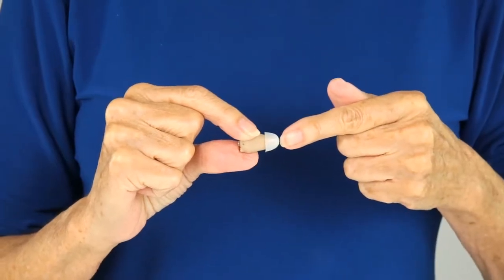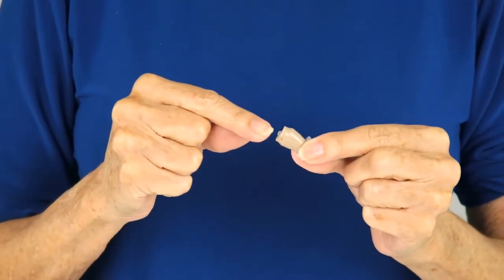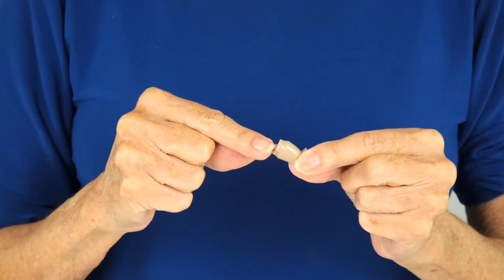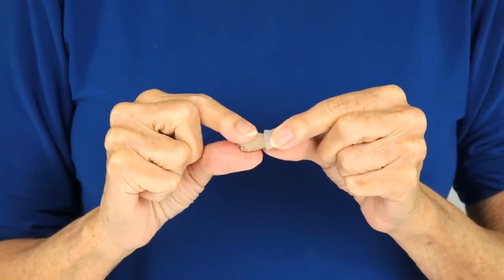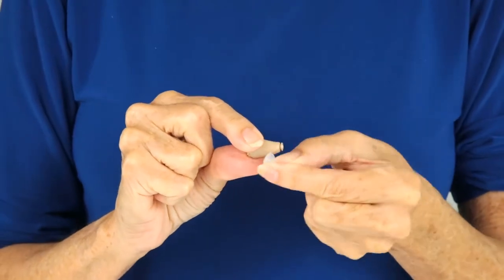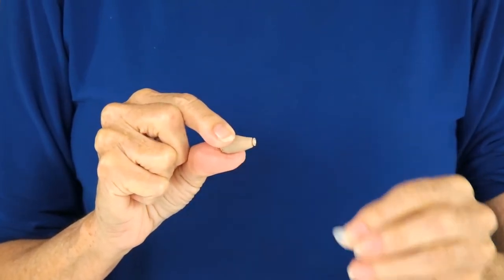To change the ear cap on the inner ear hearing amp, first make sure that the device is powered off. Once the device is powered off, peel the old ear cap off the narrow end of the hearing amp.